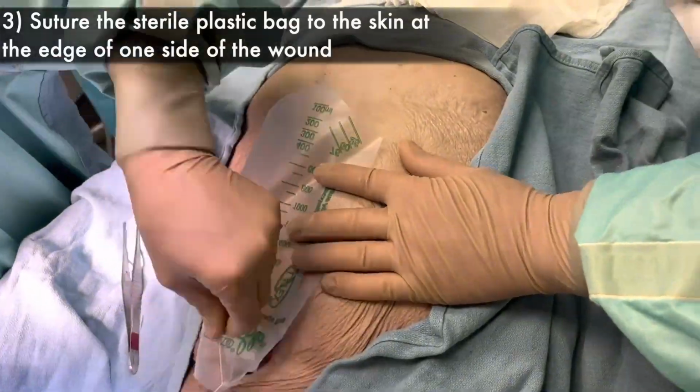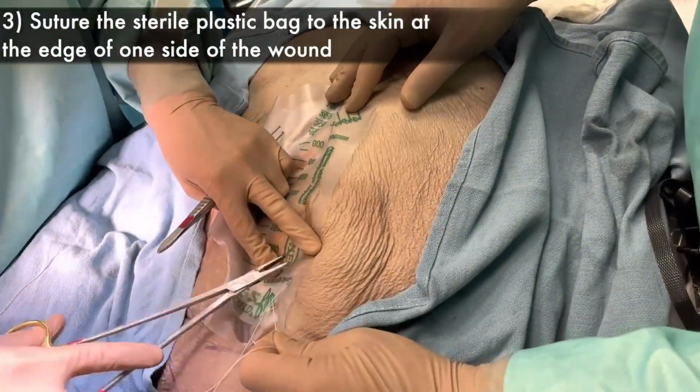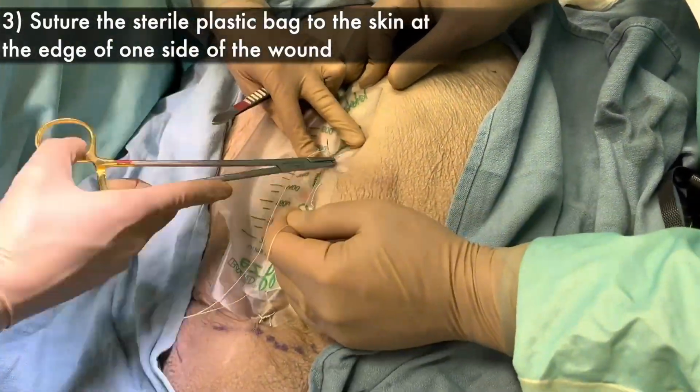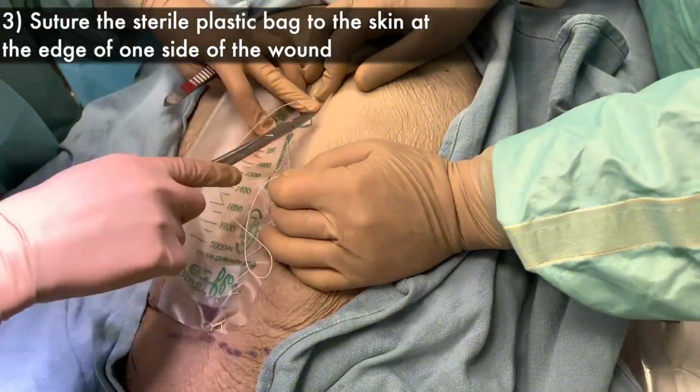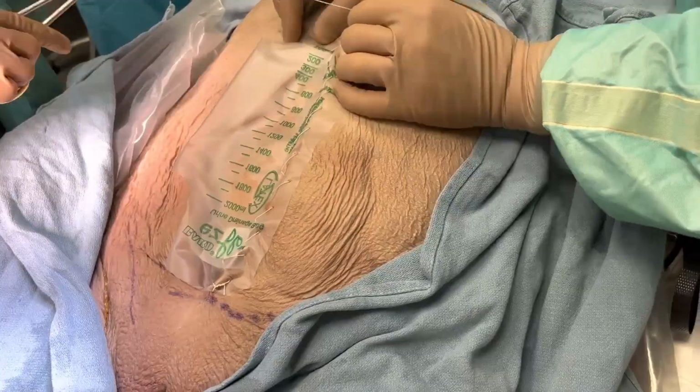Starting at the lower end of the wound, use monofilament sutures to stitch the plastic silo bag to the skin at the edge of the wound. Running sutures should be made to secure the plastic bag to the skin along the entire length of one side of the wound's edge. The sutures should be approximately 2 centimeters apart from each other.